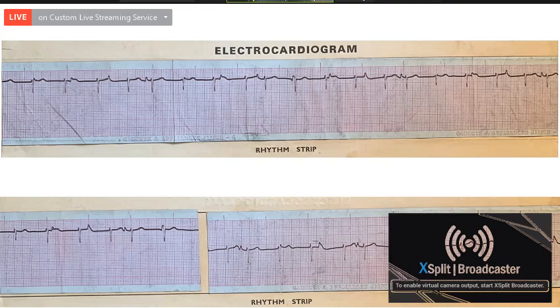Now, what is the arrhythmia? As you rightly said, intermittently the P wave is capturing the ventricular activity. The sinus beat is capturing the ventricular activity. So what is this arrhythmia? The rate is not very fast, only around 80, 84, 82.